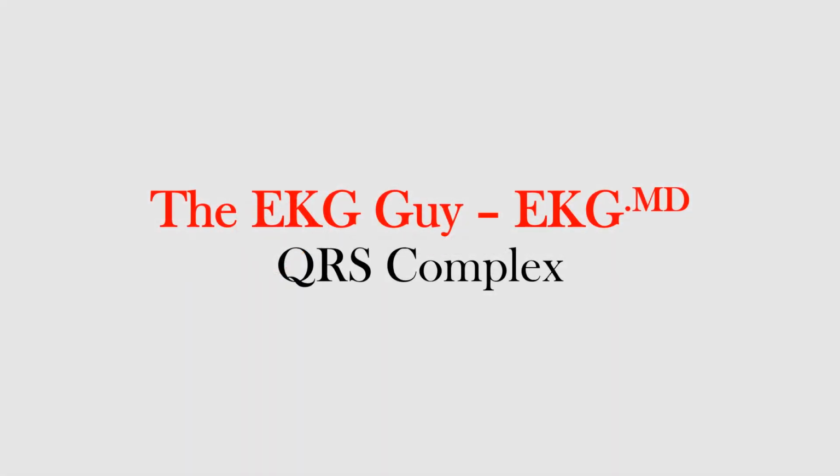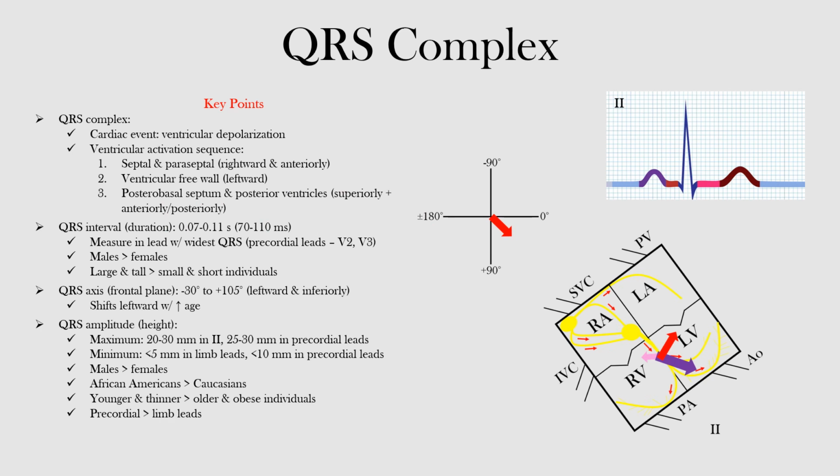In this lecture, we will discuss the QRS complex, specifically what it represents and how it should normally appear on the EKG. The QRS complex represents ventricular depolarization. You may also hear it referred to as ventricular activation or ventricular excitation. They all mean the same thing.